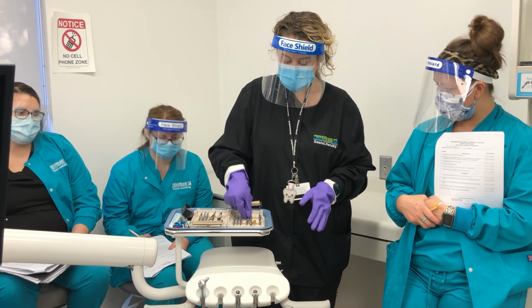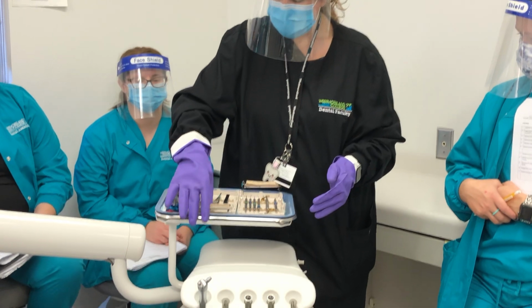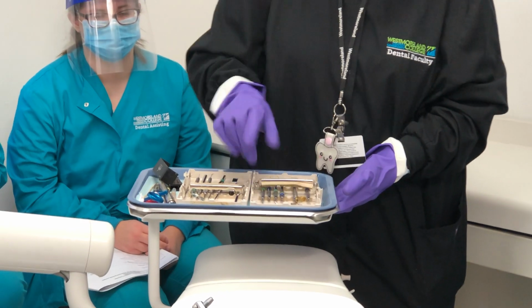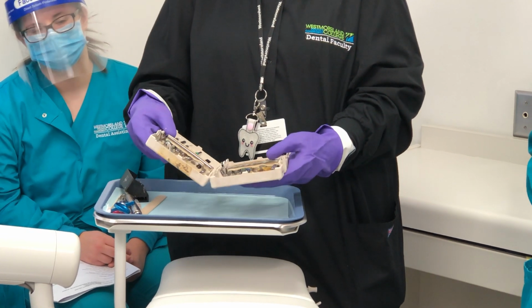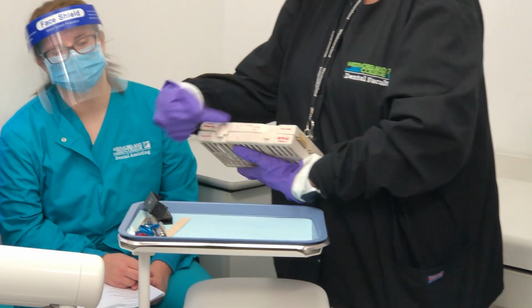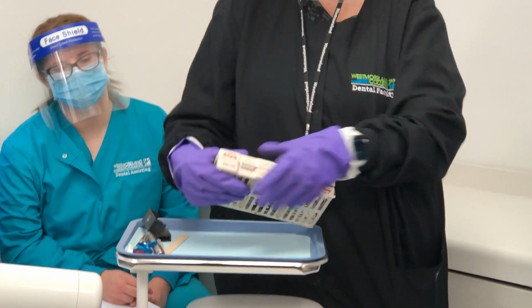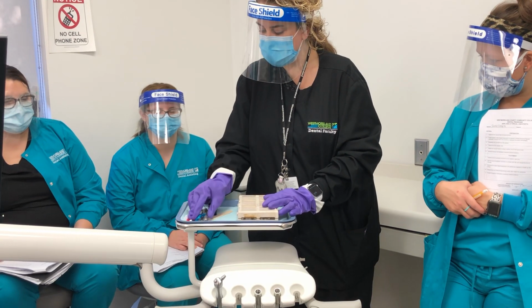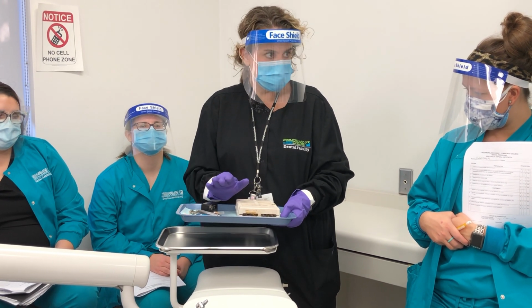So then what you're going to do is just organize. Remember, the neater the better when you open it back up for the next patient after it's sterile. So you know we have these little brackets. We're gonna push on each side to close our brackets for safe carrying. And then remember how we did this? For those that have wrapped cassettes, you fold it like a book and make sure those two little nuts are parallel. And then you just close those two little nuts. Make sure you have it nice and tight so they close, and make sure they're horizontal. So then you still have some things over to the side here, but it's nice and neat, so that if you were to crash into somebody, you have a lot less going on.